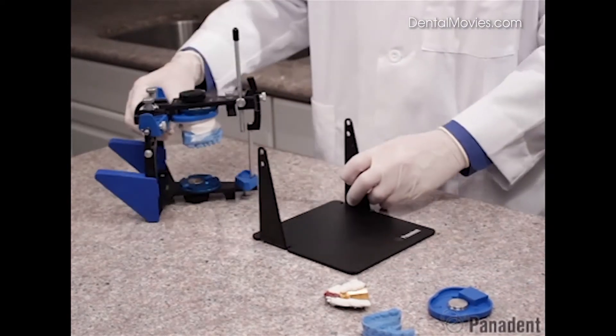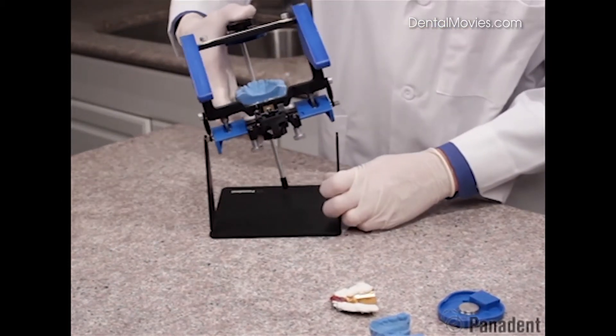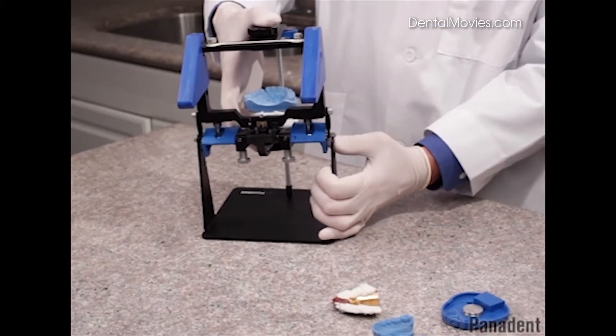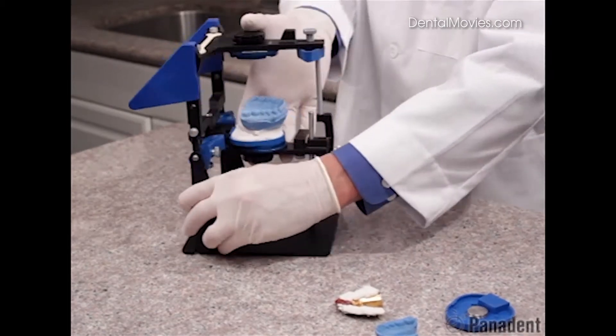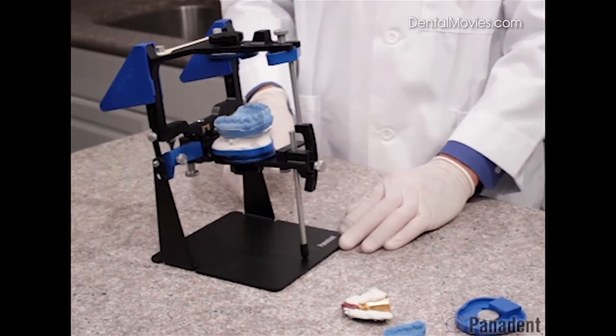Now we have our mandibular mounting stand where we can hold the articulator upside down and then put one pin into the mandibular stand and then spring the mandibular stand out over the other pin. We can then adjust the support pin here to level the articulator into the mandibular stand.